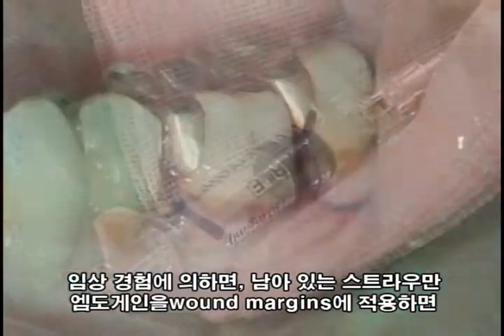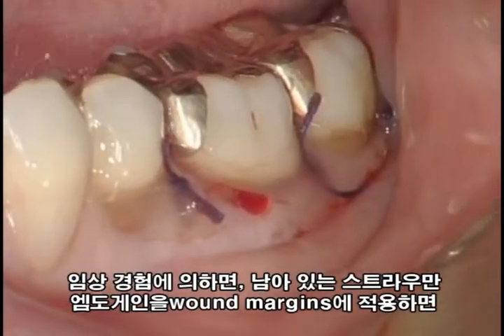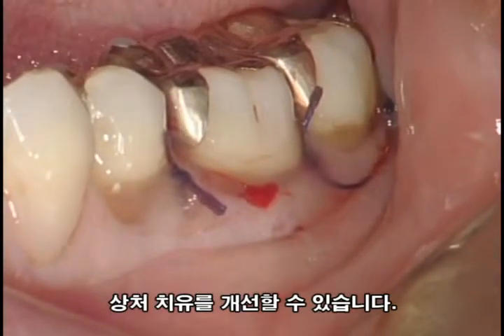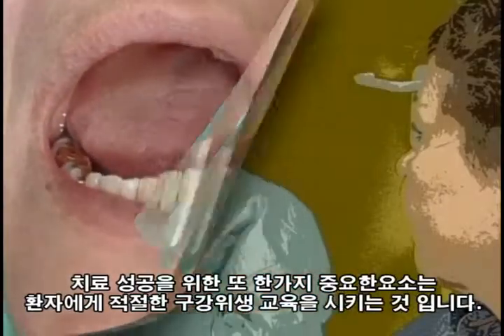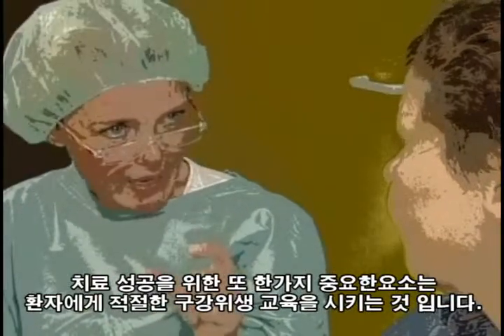Clinical experience shows that the application of the remaining Emdogain to the sutured wound margins can improve wound healing. Another important factor for treatment success is adequate patient instruction.